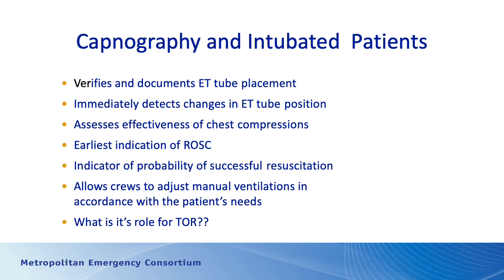So if your capnography has been at 15 for the past 20 minutes and there's been no change and the patient showed no other evidence of return to spontaneous circulation or response to treatment, you can stop. But you should consider capnography as you determine whether or not you're going to continue resuscitation, but there's no longer an absolute value in place.